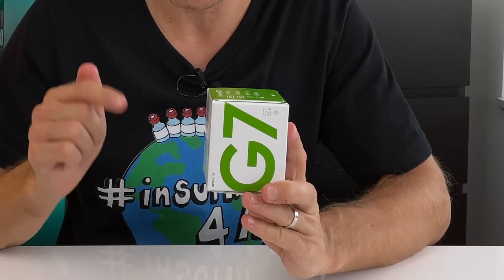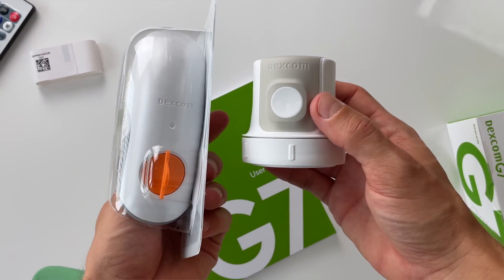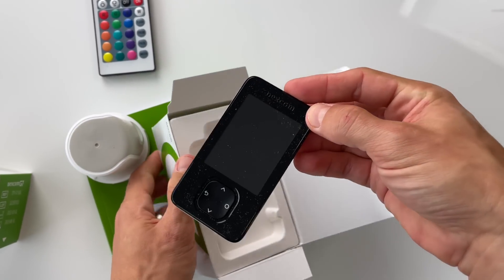I finally got my hands on the Dexcom G7 continuous glucose monitor. Look how much smaller it is than the G6 — the box, the inserter, and the sensor. Dexcom says that everything you love about the G6 gets even better with the G7, so let's see if the Dexcom G7 is really that good or if it's just good marketing.